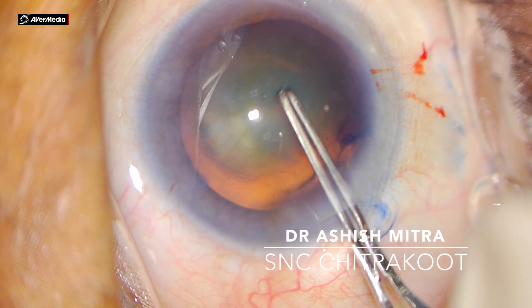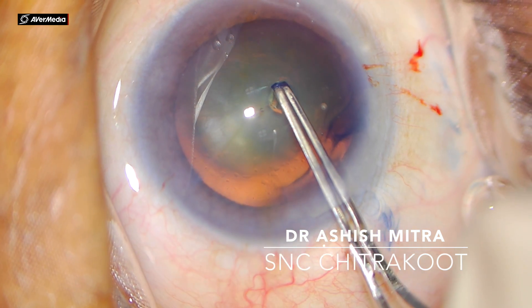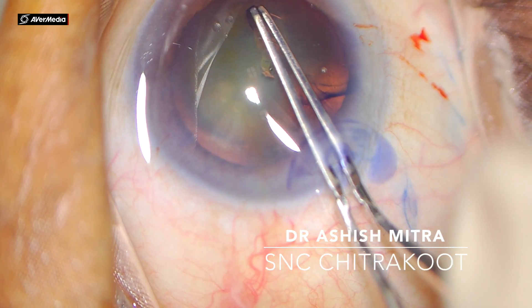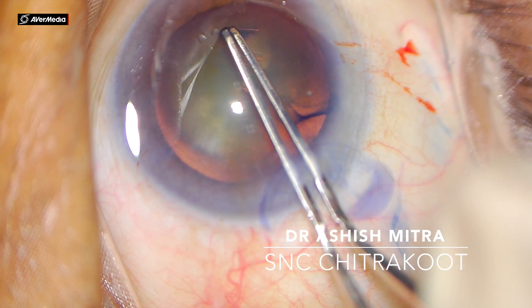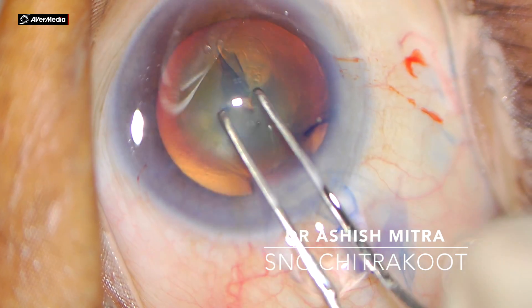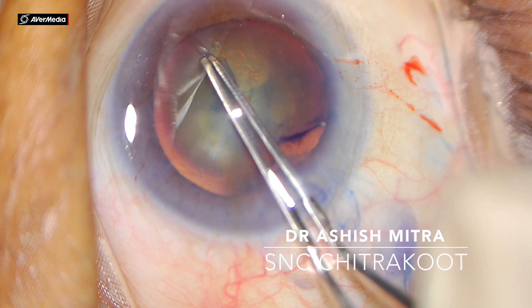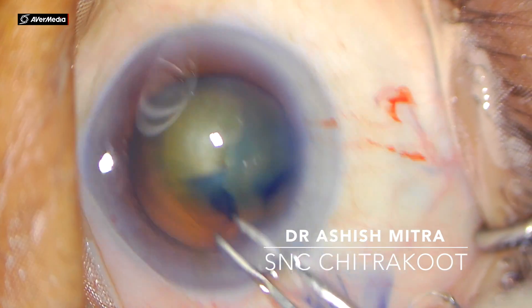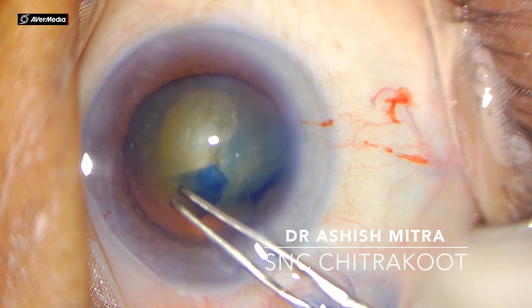See, I am creating that flap now. Take this flap to the periphery to the desired amount of rhexis which is required, then gently turn by bringing the flap towards the center. Now you turn it in a circular fashion — in one quadrant, leave it, and then since you have to change the direction, bring it towards the center slowly.